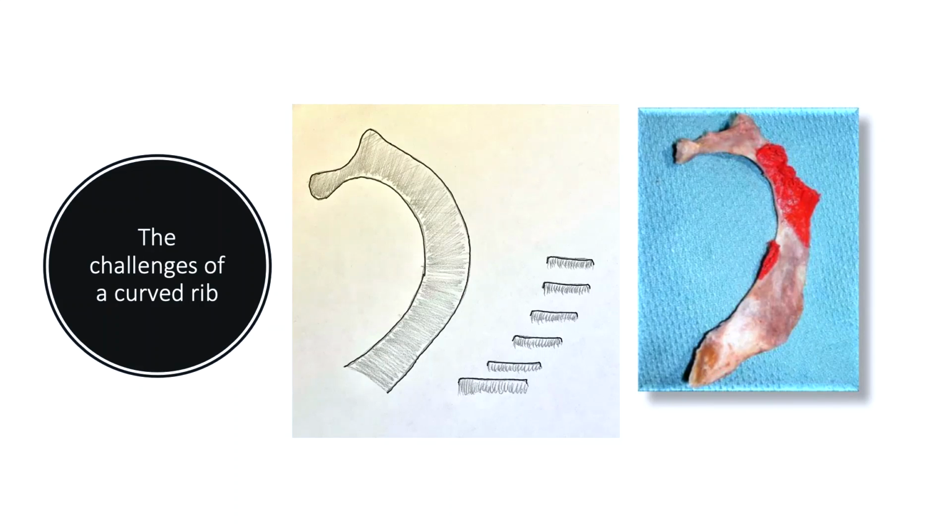So the same amount of needle that let you land safely on the first rib could actually, if drifted behind the image you're seeing, land on the pleura. And you will not just recognize it, you're seeing another image.